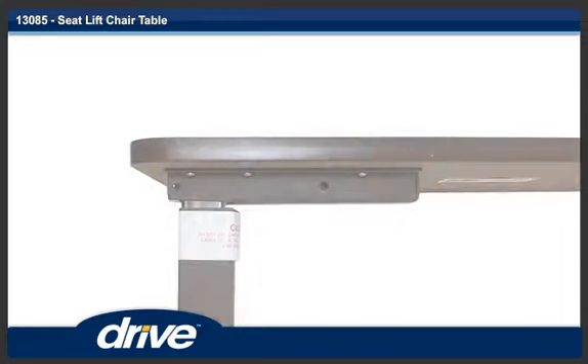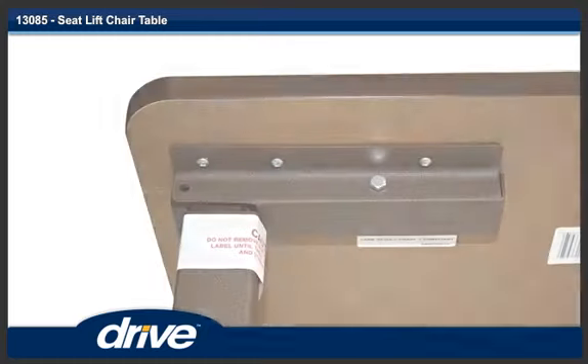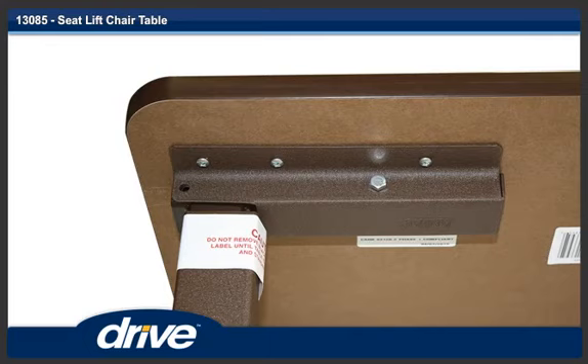Step 4. Line up the holes in the tabletop with the holes in the mast. Step 5. Insert one bolt in the hole furthest from the mast.